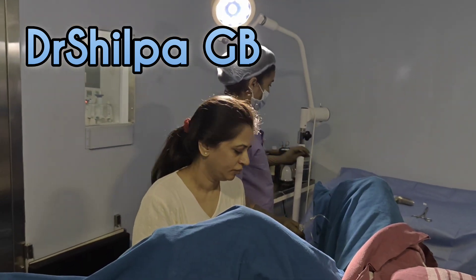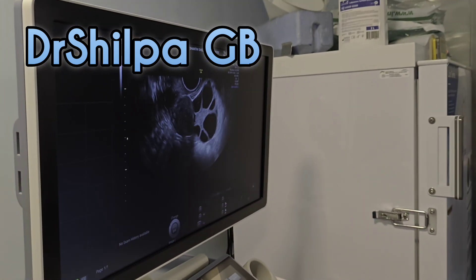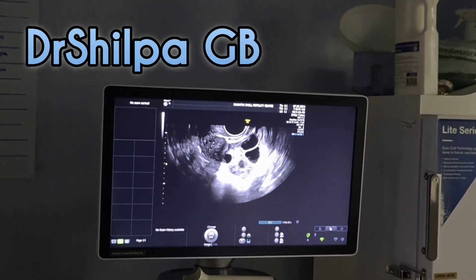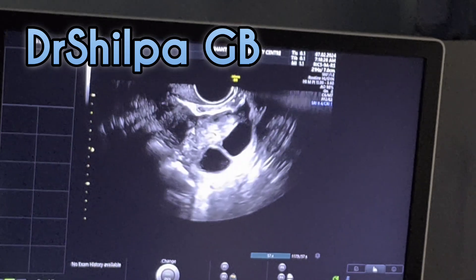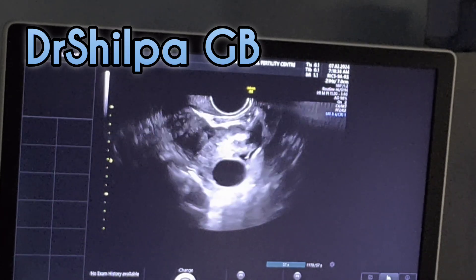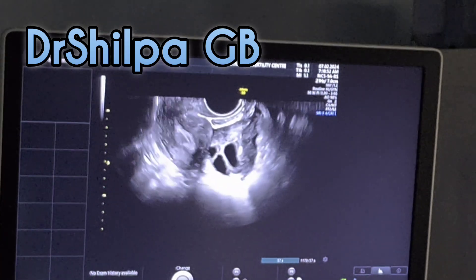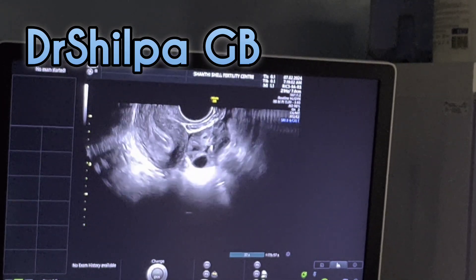You can see there is a hole here through which I will be putting in the needle, and this will go into the transvaginal ultrasound image as you can see here. Once we identify the ovaries, we start doing the punctures. This is the needle — the pressure is at 150 mmHg — and you go on aspirating one follicle after the other through this needle by looking at the ultrasound.